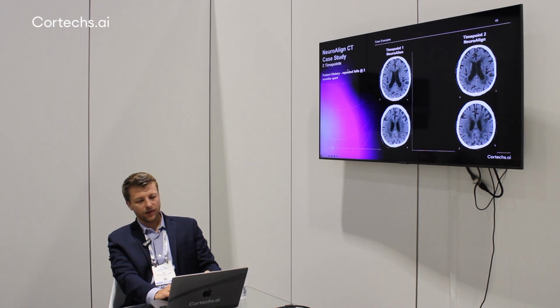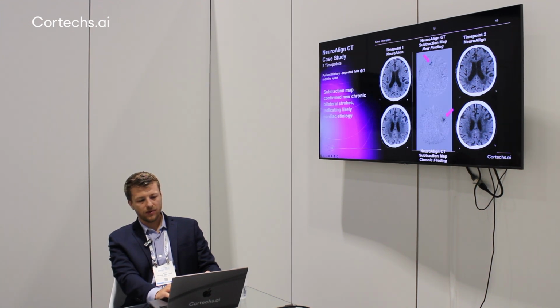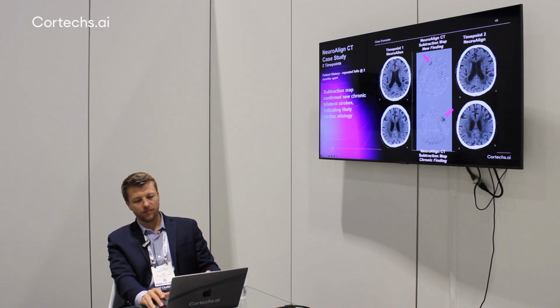This is more of a subacute setting. So even after 3 months, the patient comes back, you can do the subtraction with the scan from 3 months ago. And this patient has a lot of white matter disease, lacunar infarcts, kind of busy. It's hard to easily see a change. But with subtraction images, you can actually really identify that. In fact, this patient has had 2 infarcts in that 3-month period between the 2 time points. Having 2 new infarcts on contralateral sides suggests that the etiology, in this patient who is having multiple falls, is likely a cardiac embolic phenomenon leading to these infarcts. So again, it really helps identify the changes between the time points, helps make them pop out.